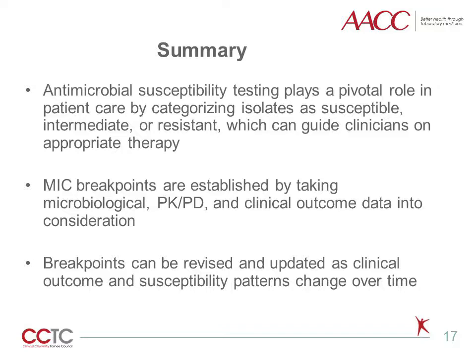Antimicrobial susceptibility testing plays a pivotal role in patient care by categorizing isolates as susceptible, intermediate, or resistant, which can guide clinicians on appropriate therapy. MIC breakpoints are established by taking microbiological, PK/PD, and clinical outcome data into consideration. Breakpoints can be revised and updated as clinical outcome and susceptibility patterns change over time. Establishing zone diameter breakpoints for disc diffusion usually requires knowledge of the MIC breakpoints.